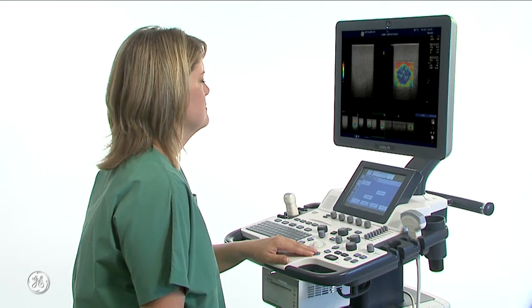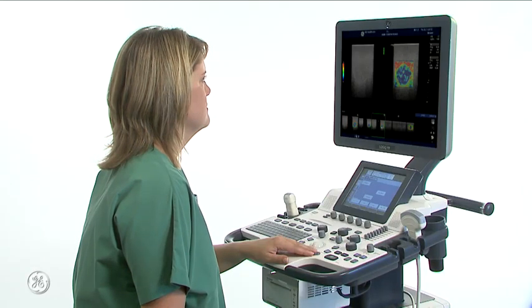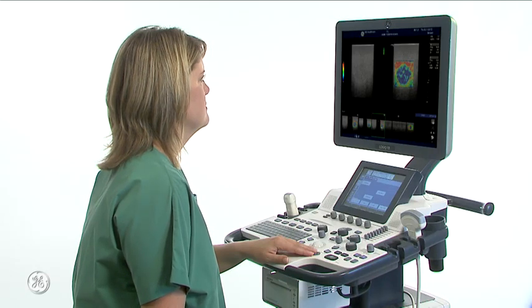The ultrasonic image of the high-quality breast sample is characterized by the following features. Relatively soft tissues are shown in warm colors, while relatively hard tissues may be indicated in blue. Harder tissues are shown in deep blue. Based on the different colors of the image, you may preliminarily assess the hardness of the neoplasm.